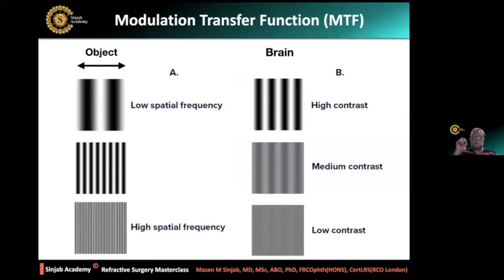Now, this tests the contrast sensitivity. Okay, so let me be direct to the point. It examines the contrast sensitivity, all right? Because what is contrast sensitivity? It is the ability of the eye to discriminate between two lines, or two points, at a given distance.